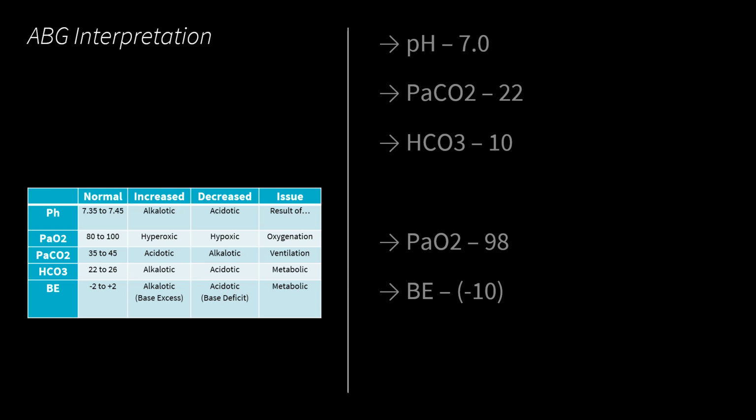Now, first off, this only is applicable if the patient's spontaneously breathing. If you have paralyzed the patient and put them on a vent and you're controlling CO2, then you could understand this and could make manipulations to help compensate, but you could also be making it worse or altering it because you're taking away the body's natural mechanisms. So again, when we're reading these ABGs, we're just going to assume that the patient's spontaneously breathing on their own and that there's nothing amok here.